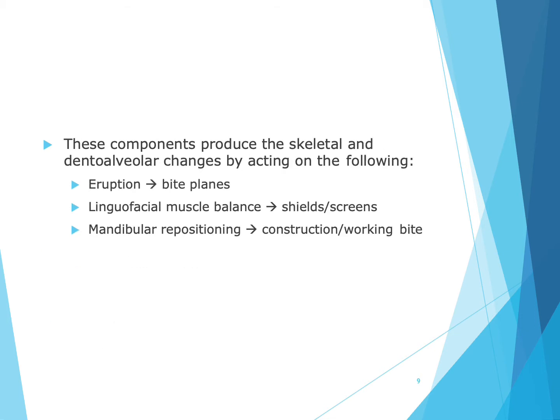These three components produce the skeletal and dentoalveolar changes by acting on the following. The bite planes act on the eruption of the teeth, the shield and screen act on the linguofacial muscle balance, and the construction and working bite act on mandibular repositioning. Now we will look at the effect of these three components one by one.